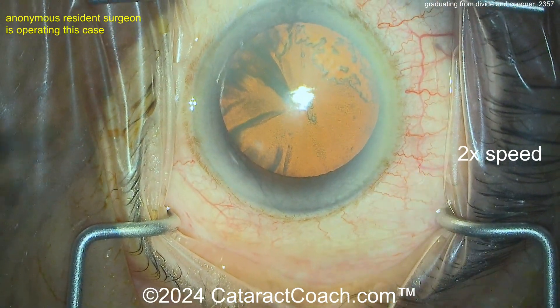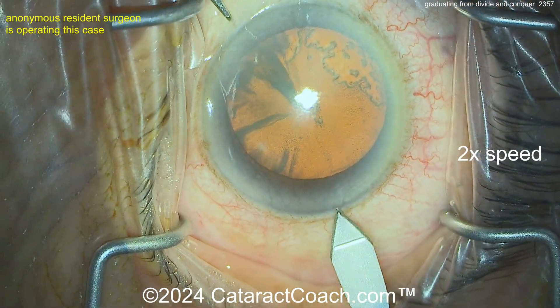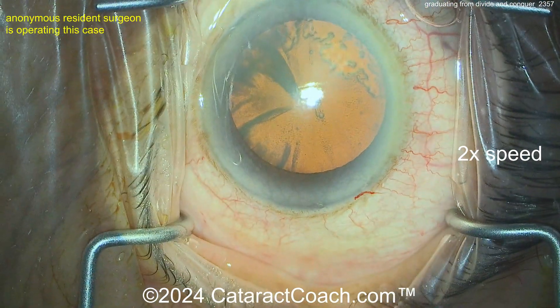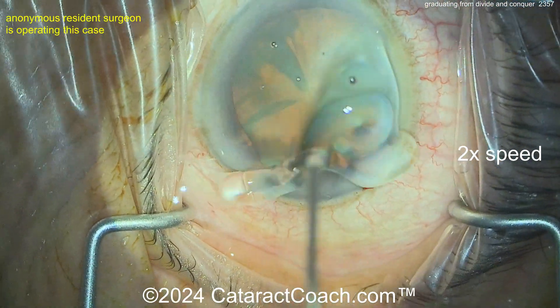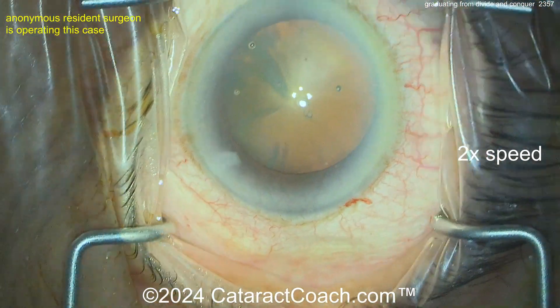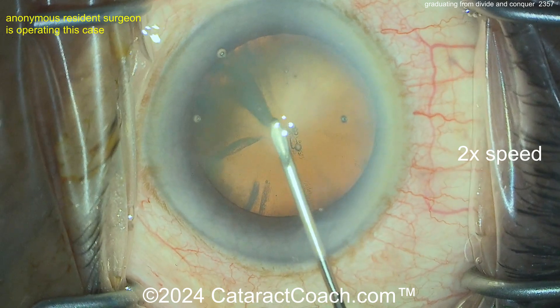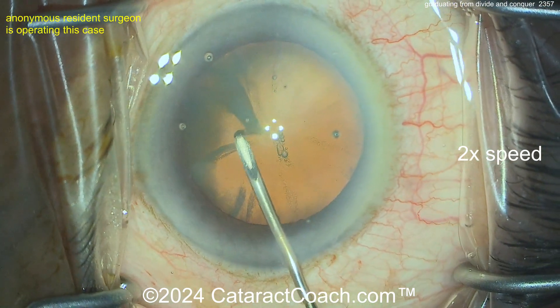I like the draping — good draping, eyelid margin sequestered properly. There's the main incision, that looks pretty good. You hit the limbal vessels a little bit — that looks reasonable. Some HPMC (hydroxypropyl methylcellulose) on the cornea, and now let's see the rhexis technique.